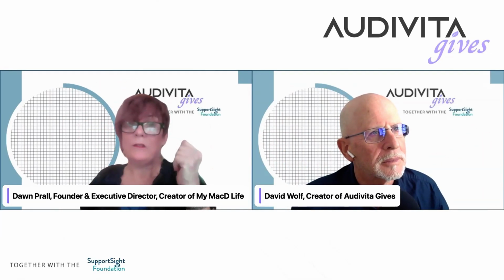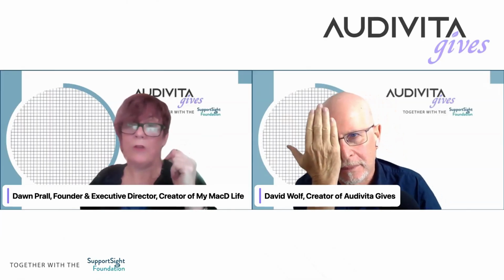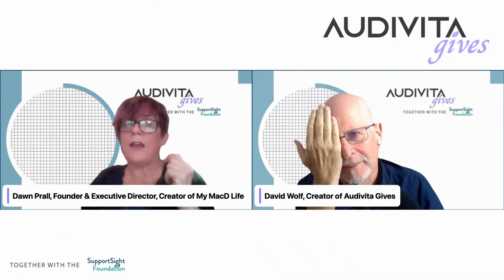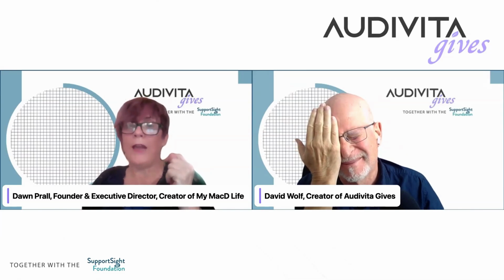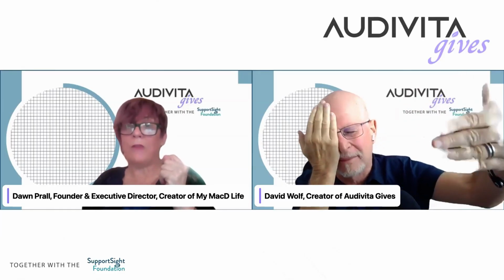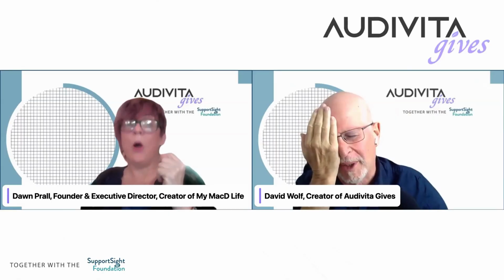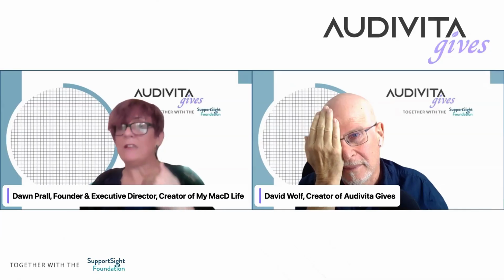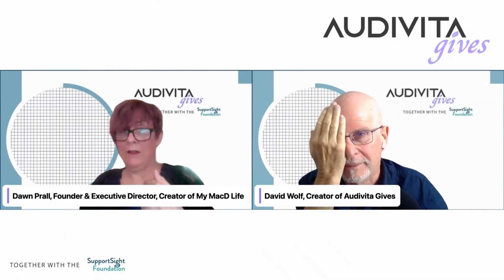David, if you want to demo that, let's start with whatever eye you want. I'll start with my left. Close both eyes. Cover one eye. Have the Amsler grid in front of you. We know you don't have one, but that's okay. Now open that eye and look at the Amsler grid and give your brain a few seconds to register it, to take it in.